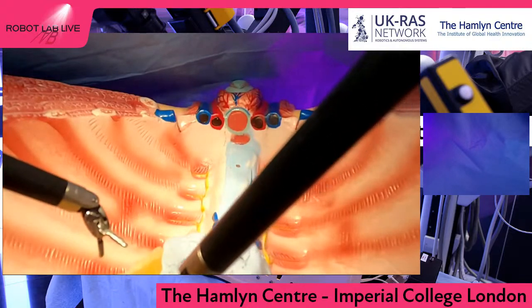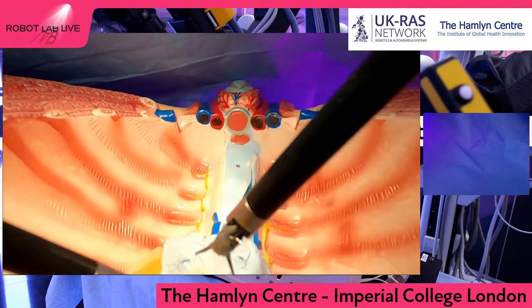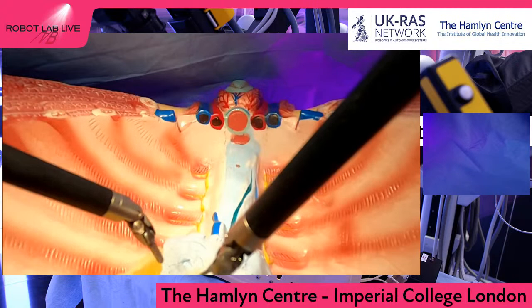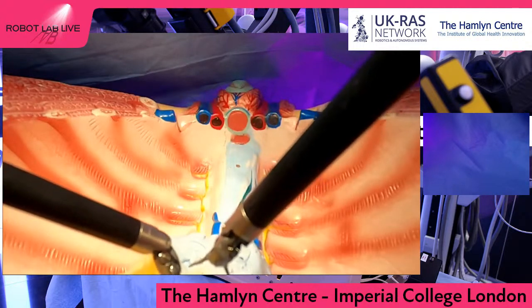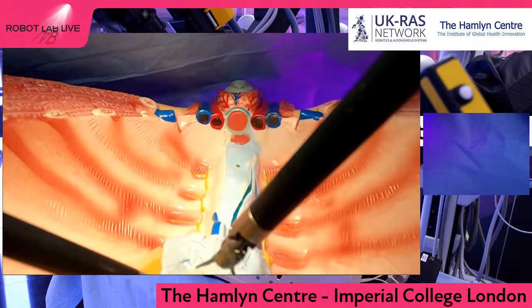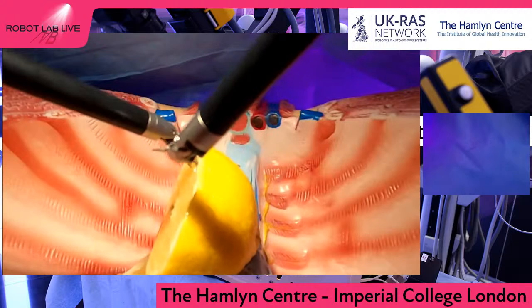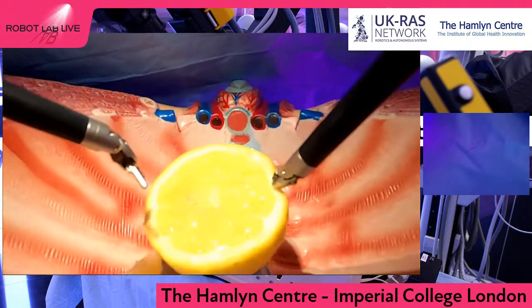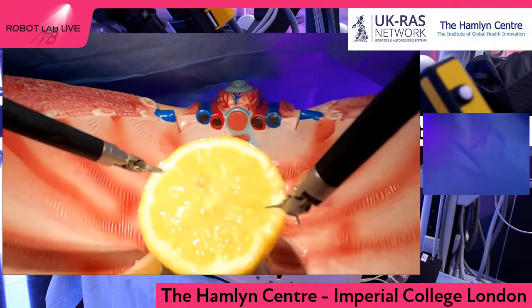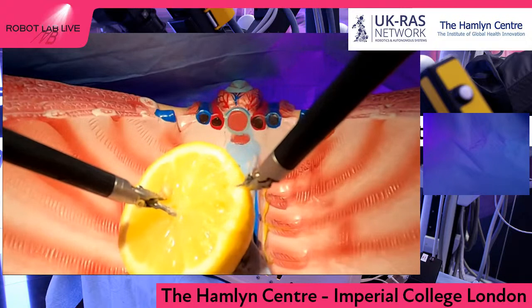Other things that would be a problem, or something to solve in case of an autonomous procedure, would be where to go, how to decide what part of the body to operate, which parts to stay away from. And all of this dynamically, as everything moves and changes. So we also have research that is able to define a safe space in which the tool can operate, and the way that we implement it wouldn't allow the robot to go outside those safe areas.